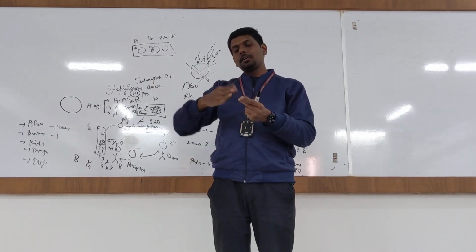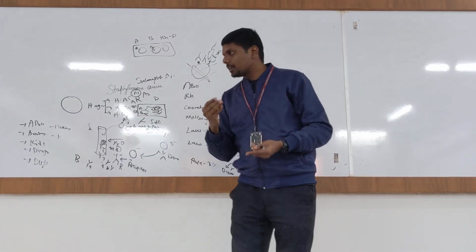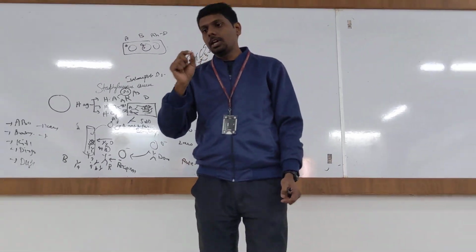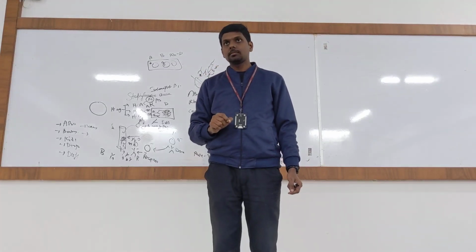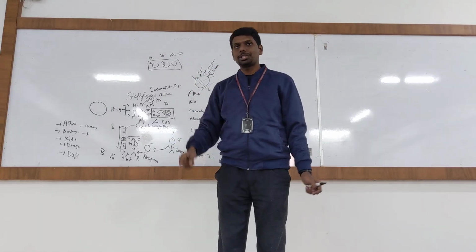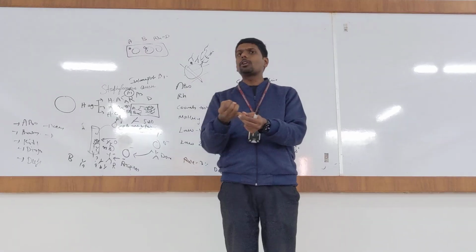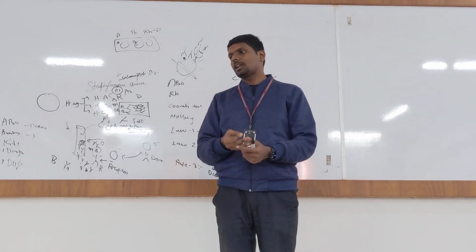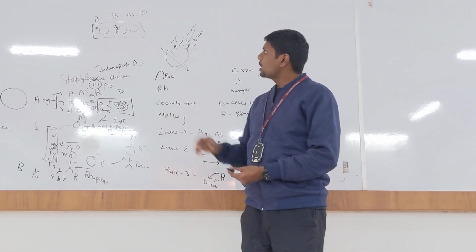Expired reagents and mixing the sample are also errors. Then a third important thing: we need to wait at least two minutes to get the agglutination reaction. This reaction is called the agglutination reaction. We have multiple reactions: agglutination, precipitation, flocculation. So there are a few things. Anyway, next question.